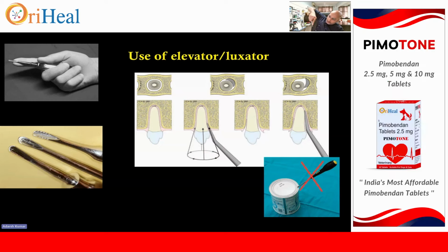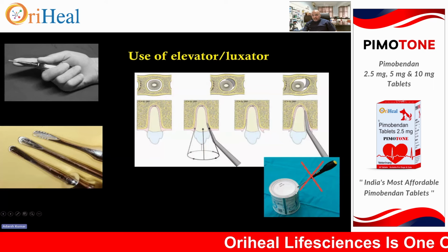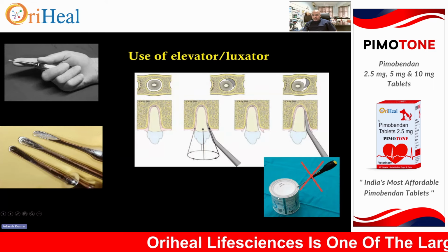If you are holding it like this, the moment it breaks, the instrument will go inside, it will be thrust inside. Okay. And don't try to apply that much prying pressure. Very little pressure. Avoid such kinds of prying forces.